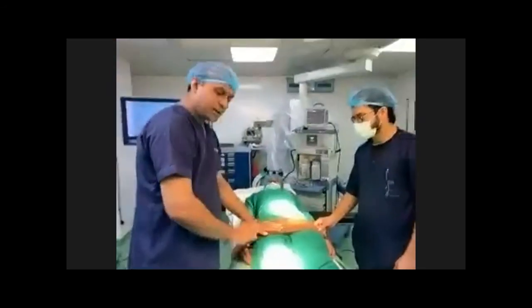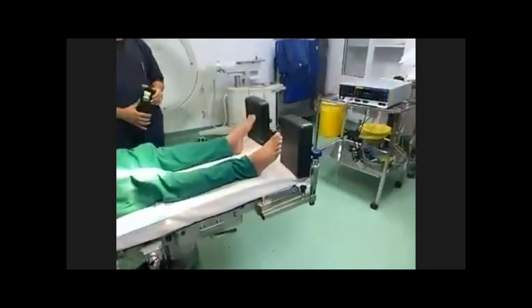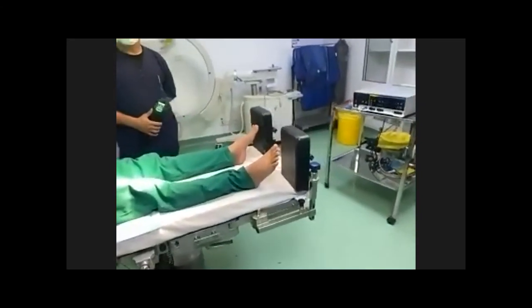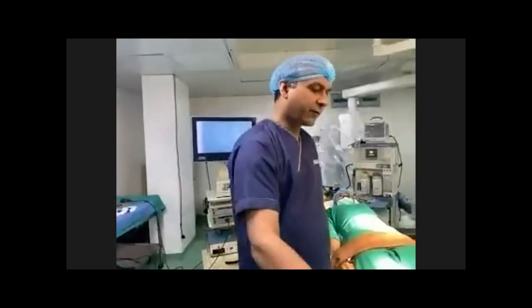Here you can see the padded foot support. You can see it from here, the padded foot support. This is very important if you are doing a reverse Trendelenburg procedure, like in bariatric surgery. This would be of great need.